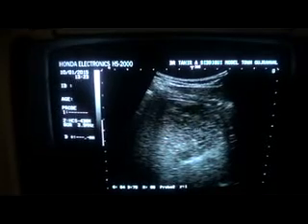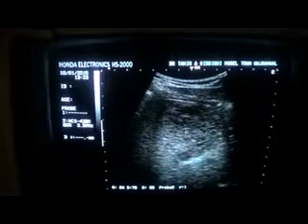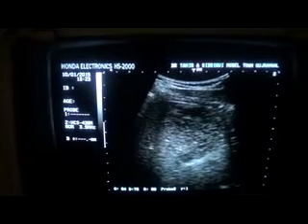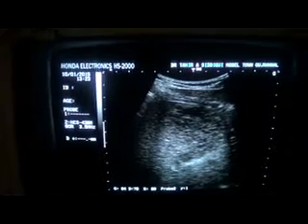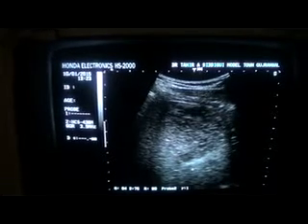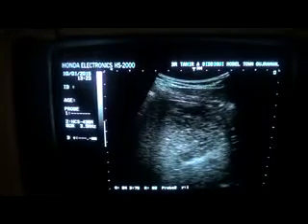If I say that this is a cystic area filled with different strength internal echoes, they are so thick that the posterior wall acoustic enhancement is not as much as we see in purely cystic areas, because of the thick echoes, thick material within this cystic area.